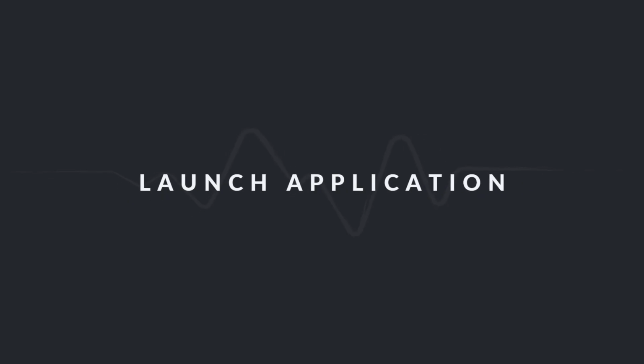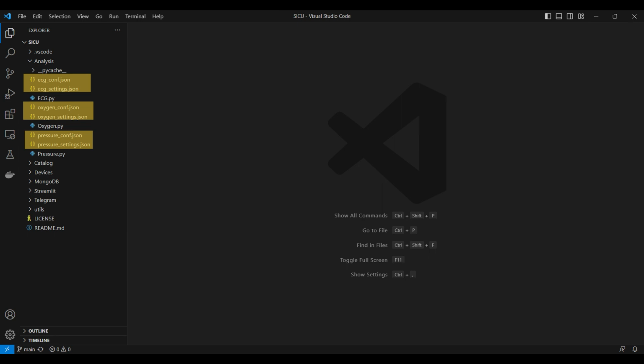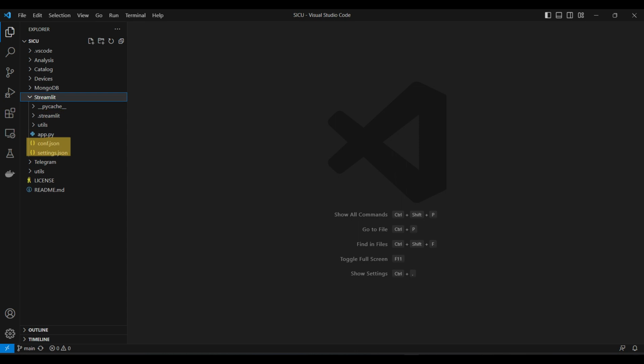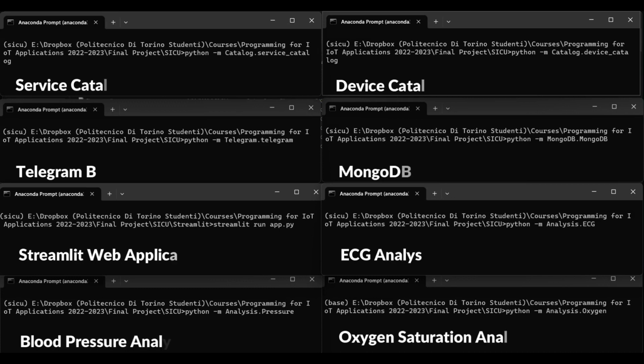In order to launch the application, I'm assuming that you have previously visited our GitHub repository, in which we have explained completely the different approaches to manage our environment and install the packages that we need in the SICU IoT platform in order to launch applications successfully. Now that we have the environment ready and all the packages installed, we can start running different microservices. The source code is written in a way that you can run different microservices in no specific order, since the microservices will wait for the service and device catalog to be run first, and then they will register themselves into the service and device catalog.